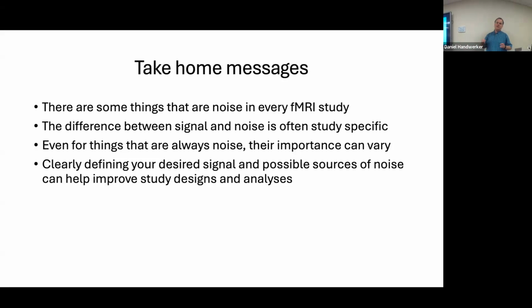The trouble is, I don't know your background in signal theory, but if you're undersampling your signal, it folds over into lower frequencies. If you're taking a sample every 2 seconds, and you have an event happening at a 1 hertz rate, it's going to fold over into lower frequencies, so you can't just filter it out. It turns out that to really get rid of that cardiac artifact, you probably have to go down to something around a 400 to 500 millisecond sampling rate.